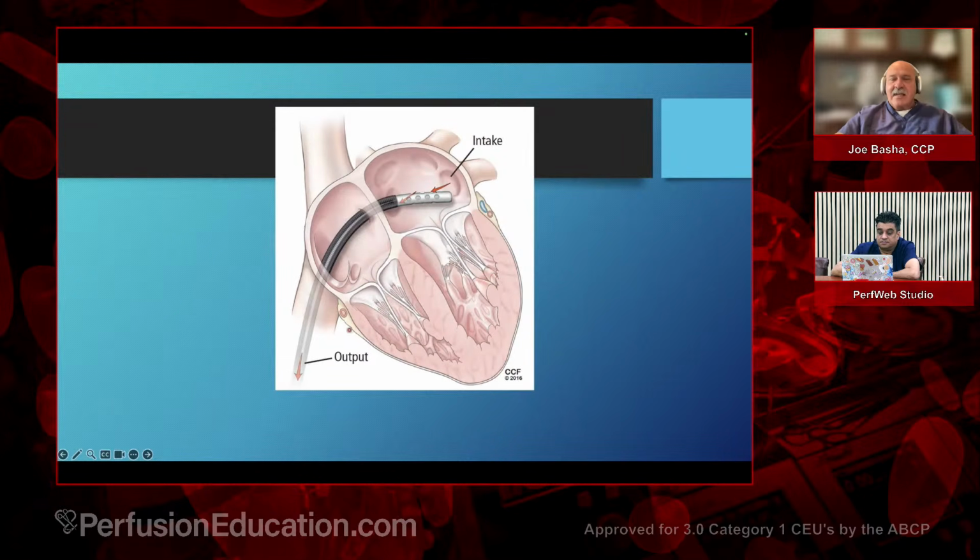This is that cannula that I showed you. You can see it coming up through the inferior vena cava, dumping into the right atrium. There's your coronary sinus, and there it is going transeptal, and here's your drainage here. So this will help to keep this decompressed, not as well, but pretty well.